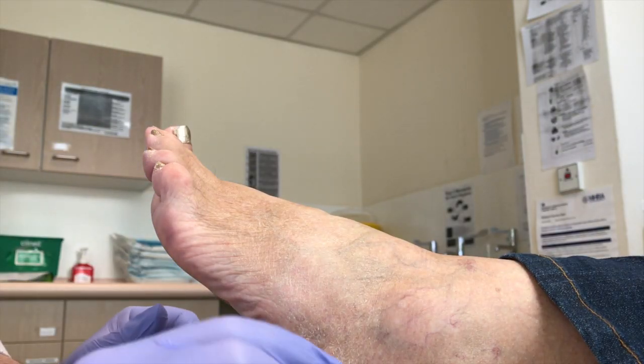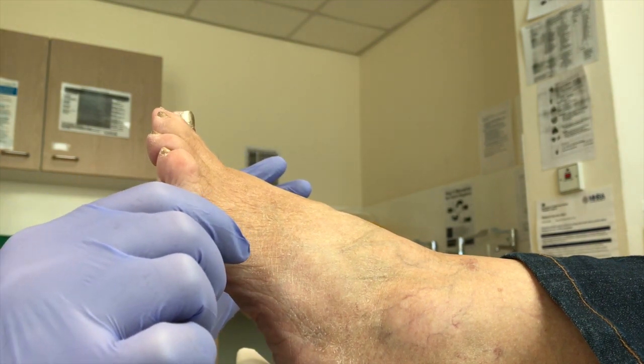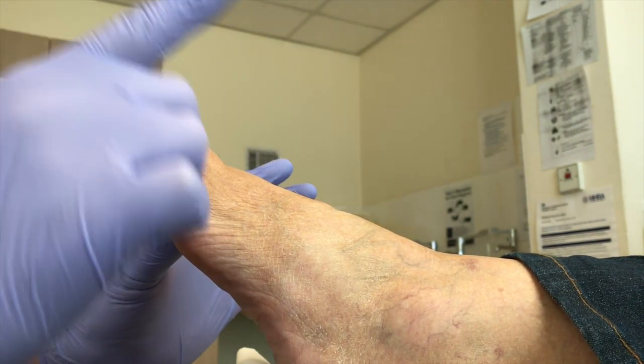This lady is having a Morton's neuroma injection. She's had them before. How many injections have you had before, Maria? One on this side.